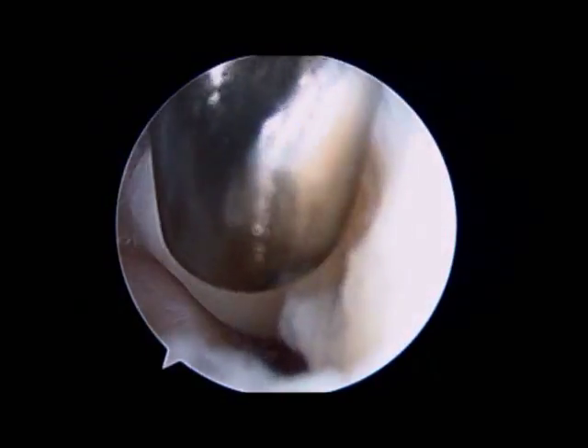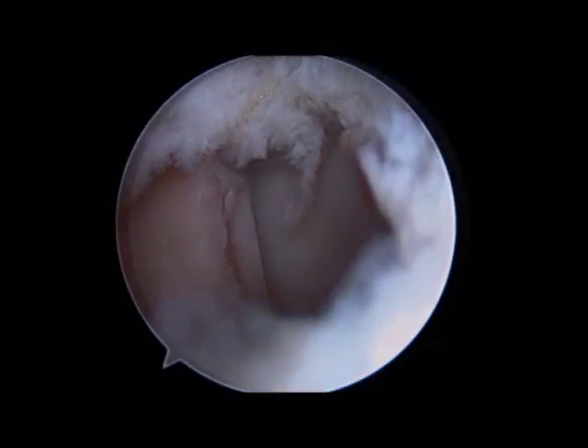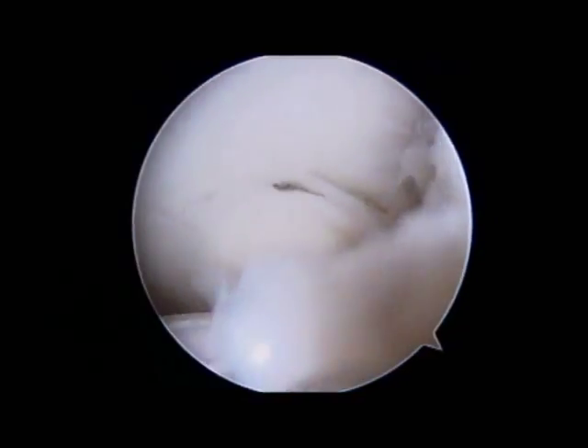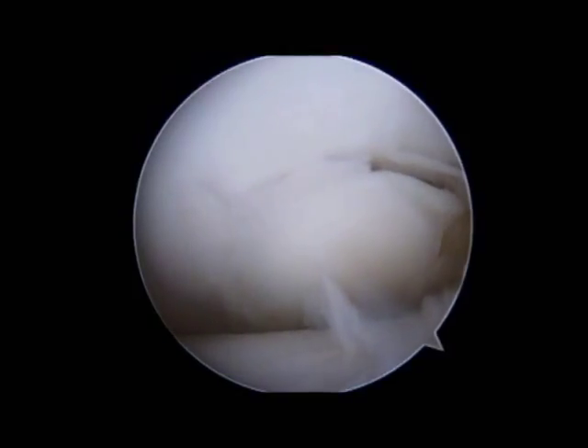The loose body comes out without any difficulty, allowing better vision of the joint as well as resolving a portion of the patient's problem. You can see the radial head below and the capitellum above. That circular defect in the cartilage directly ahead is the OCD lesion itself.